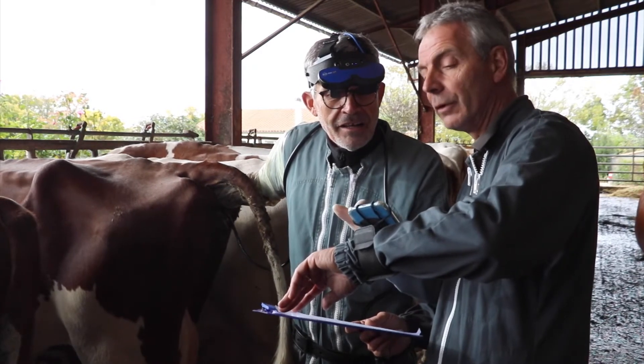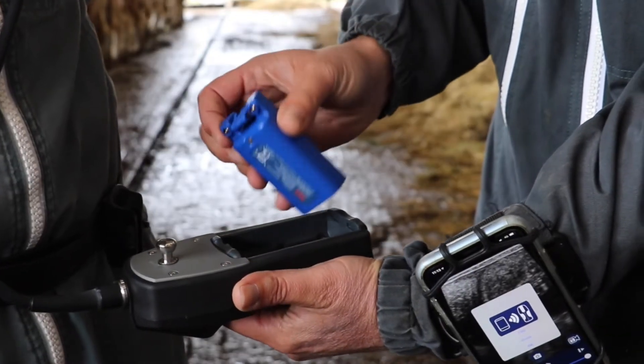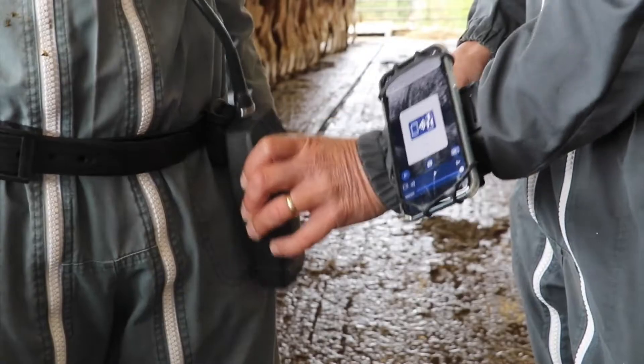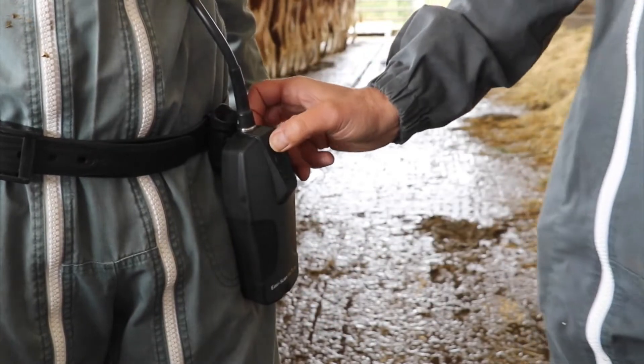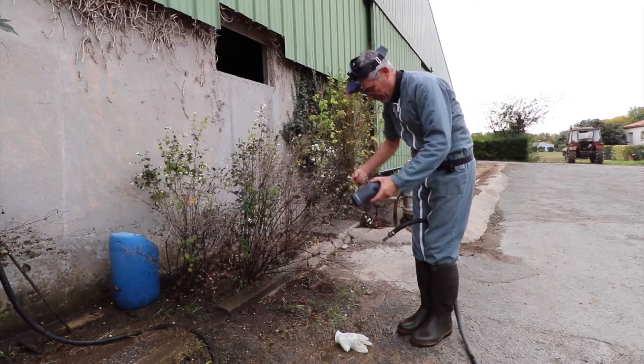You don't need to stop scanning when the scanner needs to be recharged — simply swap the battery in seconds and carry on. When there are no cables or connectors, it's completely waterproof.